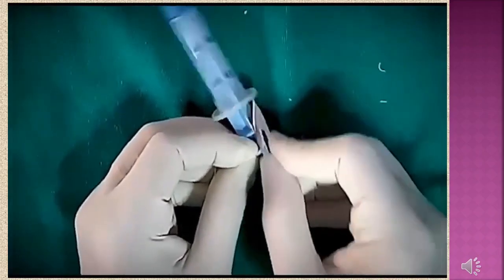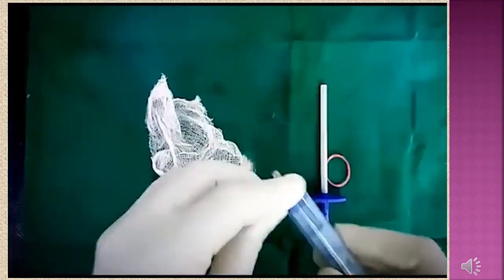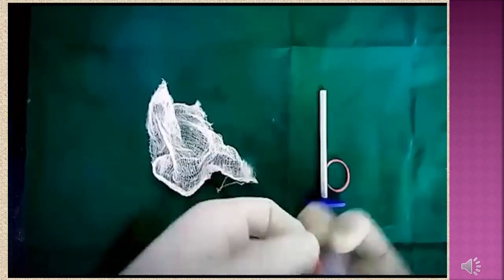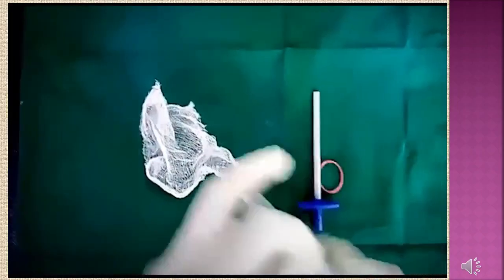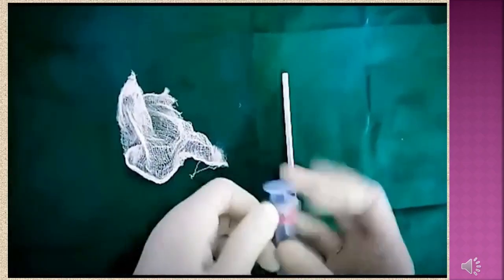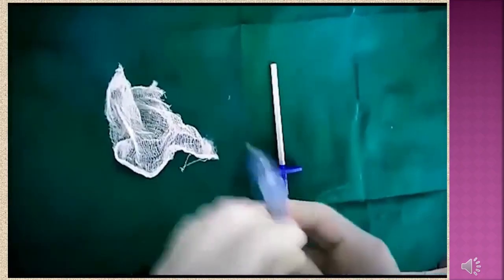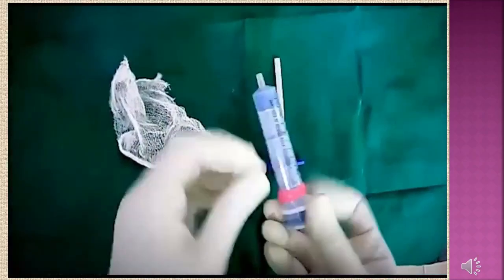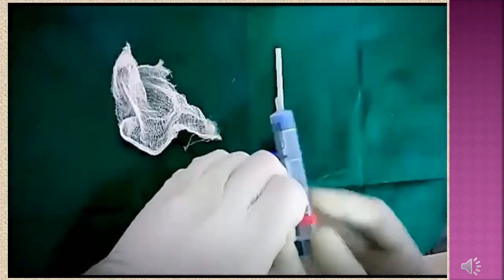Now after making slots, rubber bands which are autoclaved in the gauze pieces so that they should not melt, are attached on the syringes, as you can see. They have to be attached like this on the syringe. Now we have to check the tensile strength of the rubber bands. It should be slightly loosened out.